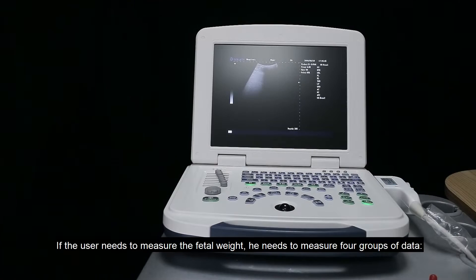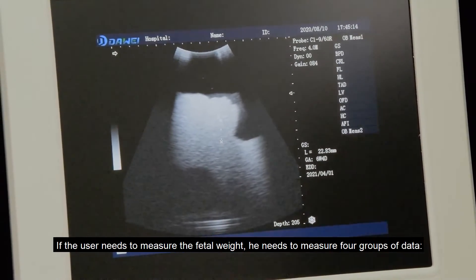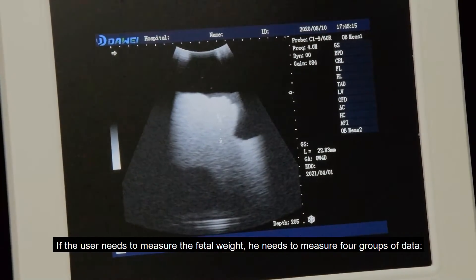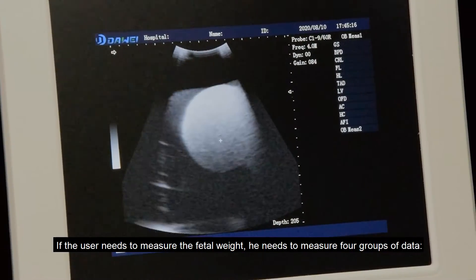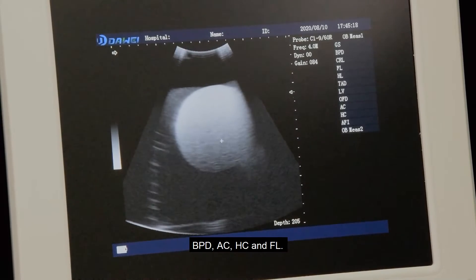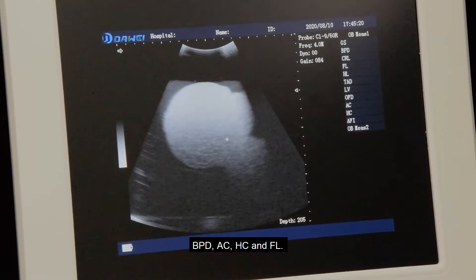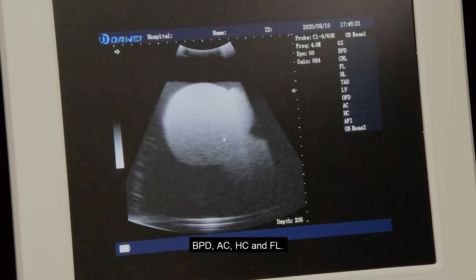If the user needs to measure the fetal weight, they need to measure four groups of data: BPD, AC, HC, and FL.